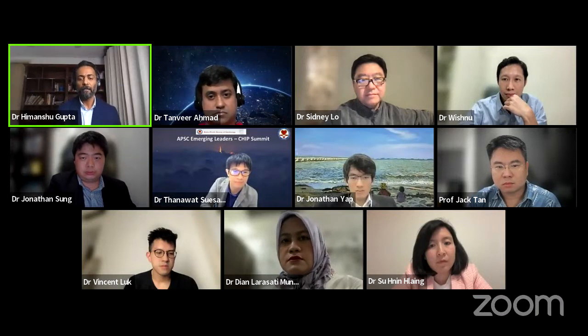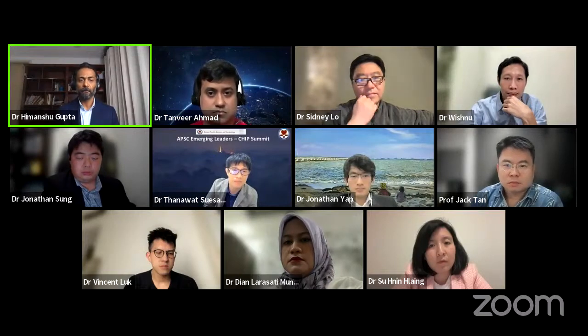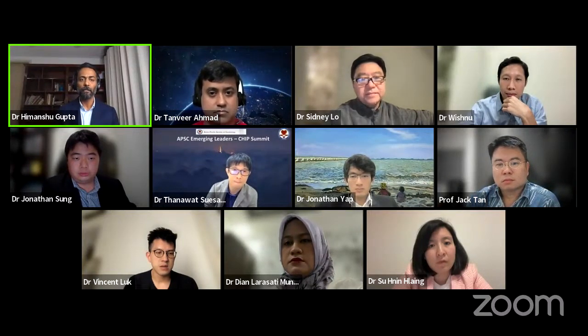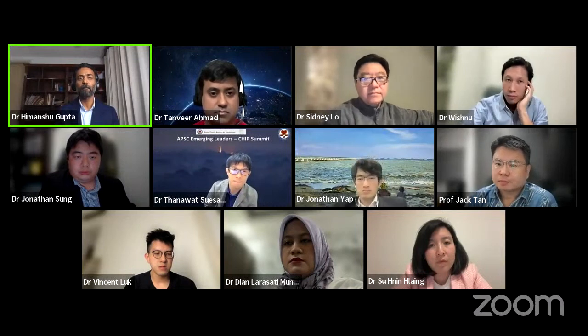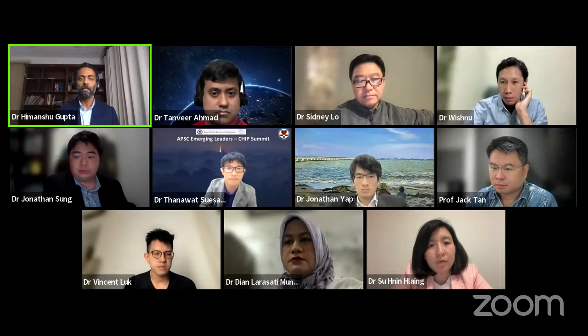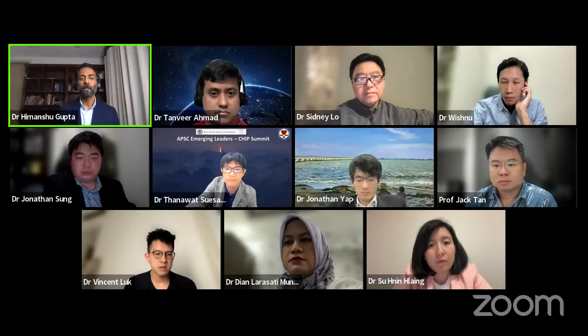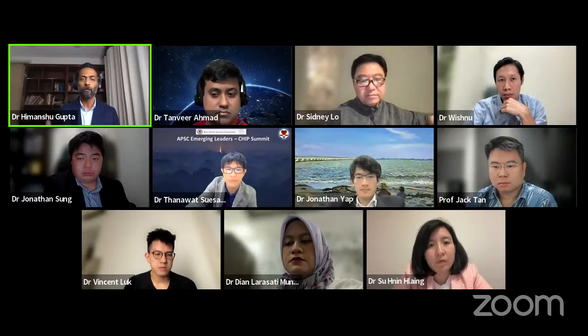Yeah, thank you. I think for the nodular calcium, rotablator, and probably orbital, we don't have much experience with orbital. We have panelists who use it, but we don't have it in India yet. We have it just a month back. So I think the largest possible burr, depending upon the clinical condition of the patient, is probably the best device for nodular calcium. Like in the first case, he was elderly with diffuse disease, with low EF, we ended up using only a 1.5 millimeter burr and we had the rupture of an IVL with the nodular calcium. Whereas in the second case, it was a normal ejection fraction, focal lesion. So we were very comfortable using a 2 millimeter burr because we know we don't have a slow flow, no flow situation in this scenario.